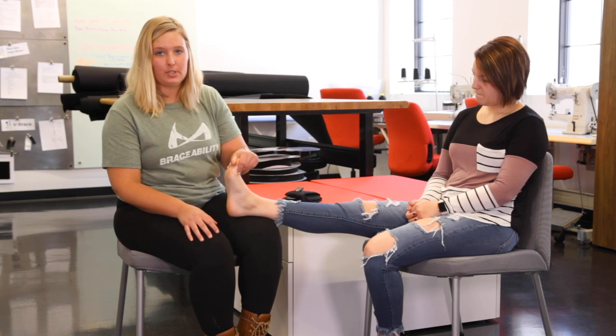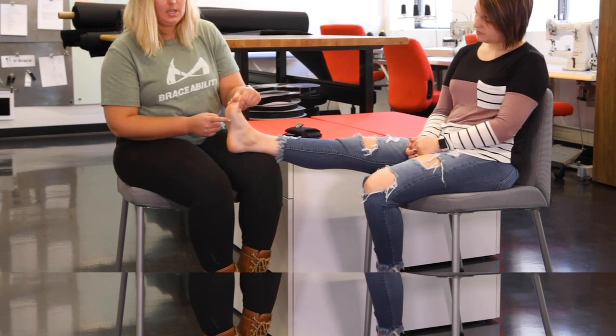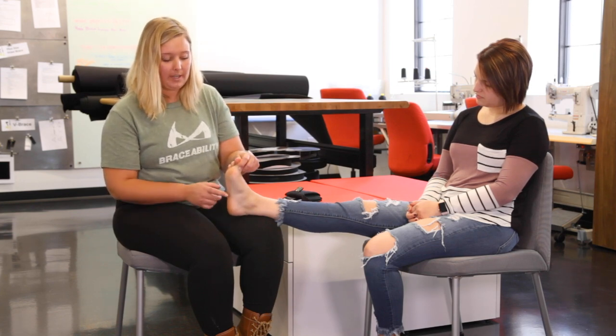When I pull her toes back like this, you can actually see the plantar fascia tissue being stretched right here. The idea of a night sock is that it pulls the toes back throughout the night so your plantar fascia can heal in this stretched position.